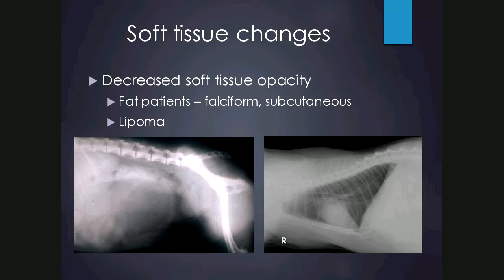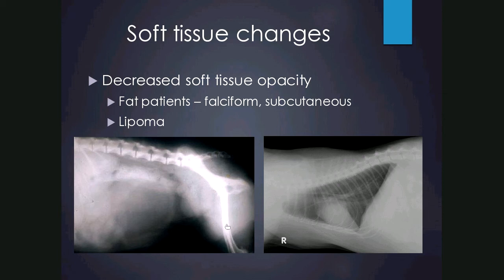Decreased apparent soft tissue can also be due to fat, which is more radiolucent than soft tissue. In obese patients any falciform or subcutaneous fat is more radiolucent than structures such as the liver and heart. Lipoma has the same effect — a large more radiolucent fat-opacity structure within the abdomen can be seen to differ from the small intestines, bladder, and pelvic limb muscles, consistent with an intra-abdominal lipoma.